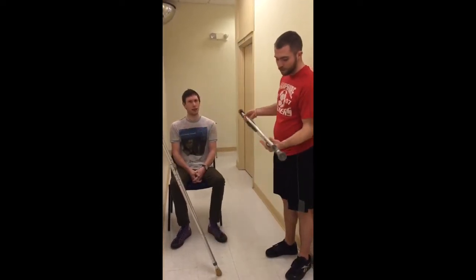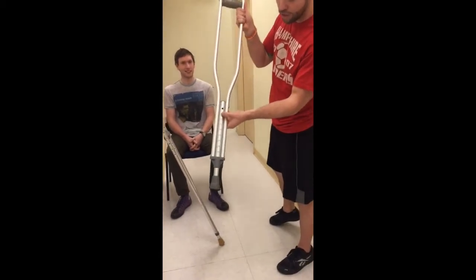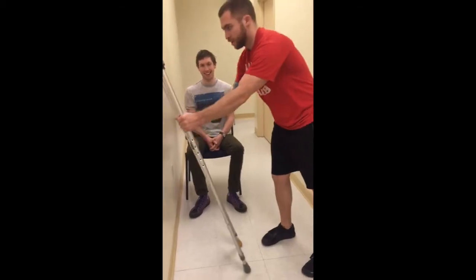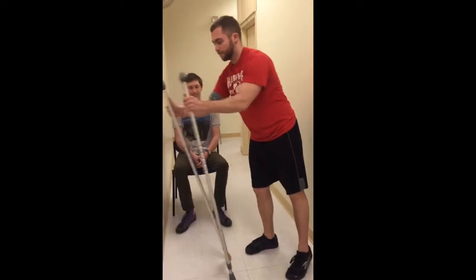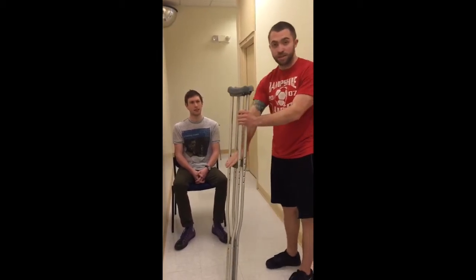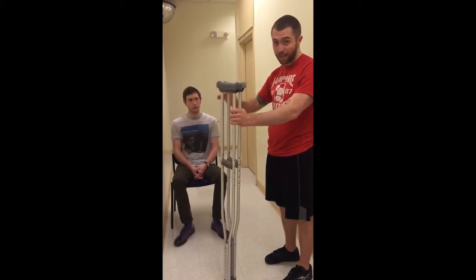So the first thing that we're going to do is we're going to adjust these crutches. As you can see down here, you're just going to press in, and then you can adjust the height. These are already set to 5'11", so I don't have to change them. I'm going to do this on both. So we are all set. We've already instructed Will on how to stand up with the crutches. So what he's going to do is stand up, and then we're going to measure them in standing, and then sit him back down.